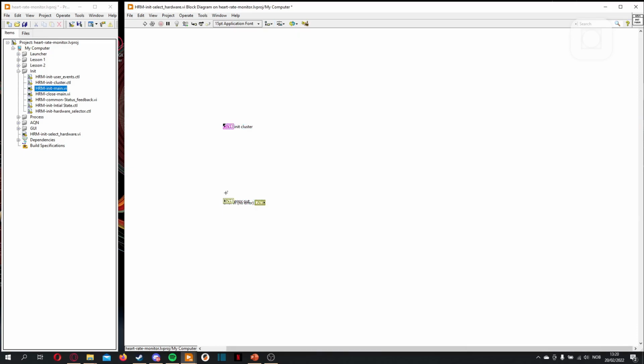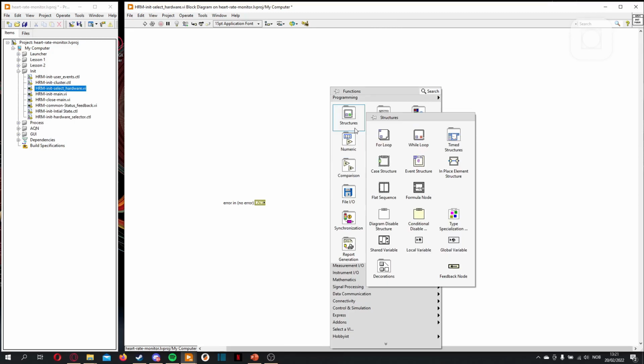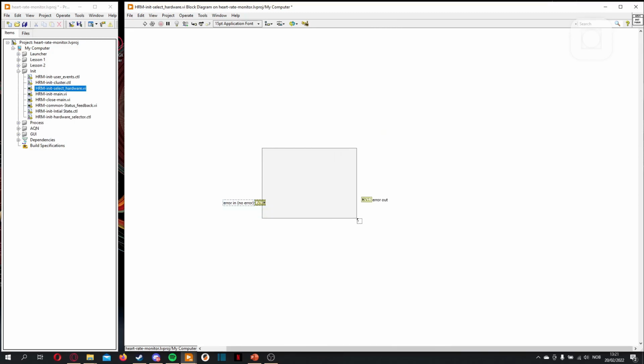Just use this function to get everything close by again. We don't need this one. We can have an error if we want, but we can mostly use that one just to ignore the questions if there is an error.